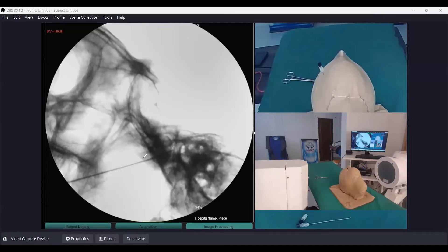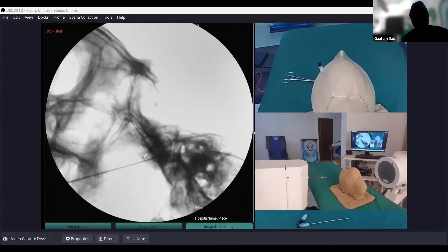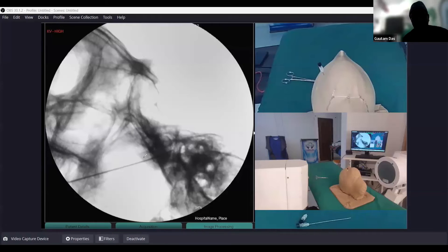Even if you see tricks of blood coming out of the needle, you need not panic. You can reposition, but still if blood is coming, do not manipulate the needle much here because all nearby important structures are present. Blood coming is not a contraindication — you can still go ahead with the procedure. The problem with blood is that you cannot give local anesthetic in that situation. Instead, give a short anesthesia — stimulate first, and if the position is perfect, give a short dose of propofol.